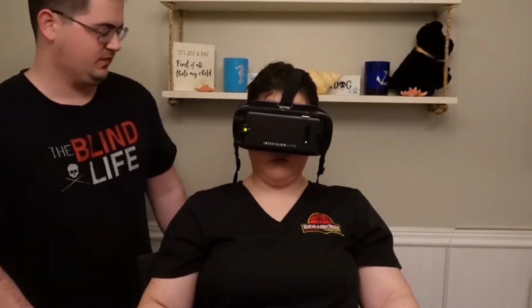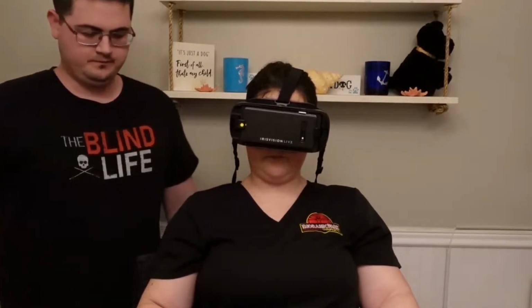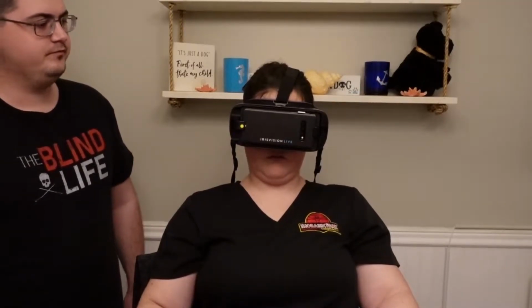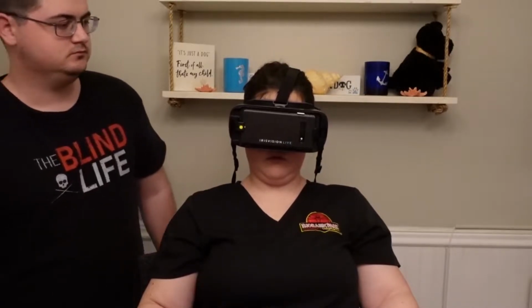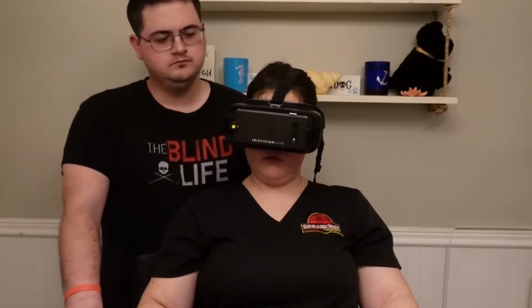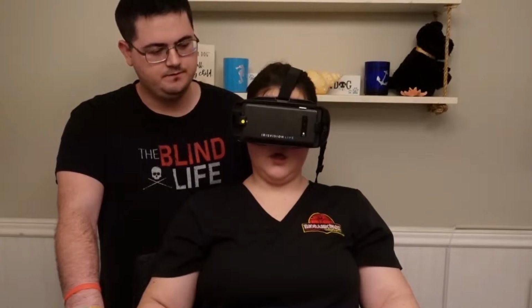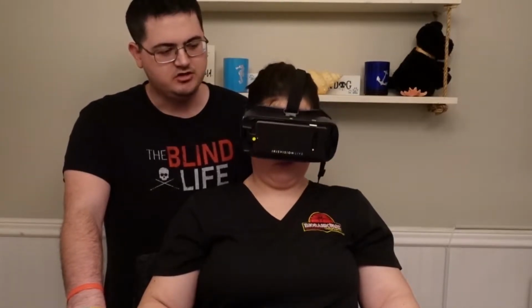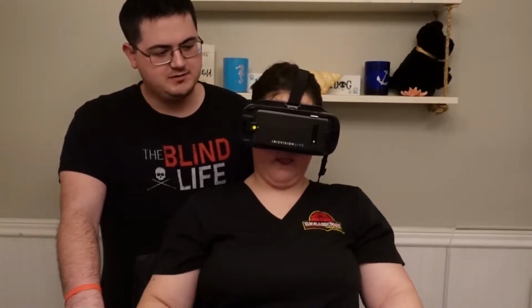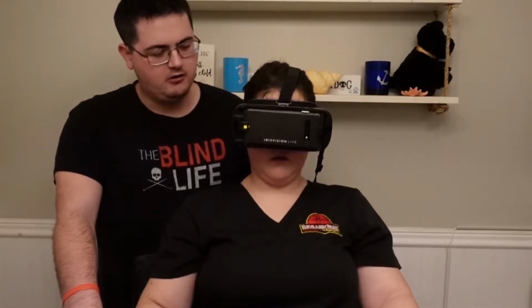After powering on your headset, it should automatically show focus mode. It contains an image with beach chairs. If you are not in focus mode, press the mode button until you hear focus and see the large bold letters. All right, Lexi, tell us right now, what do you see? You're on focus, correct? Do you see the bold letters? Yes, at the bottom. Now, there should also be beach chairs. Can you see the beach chairs? Yeah, they're in front of me. Do you need to focus it at all?